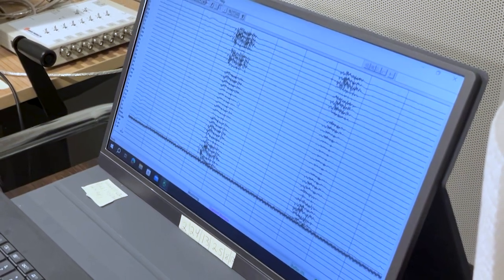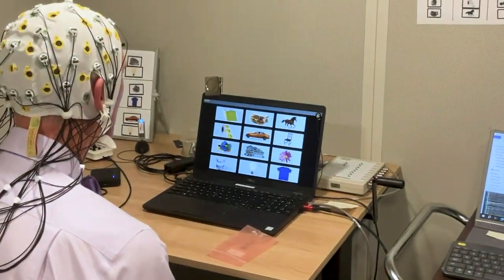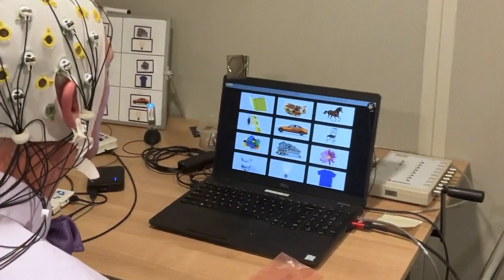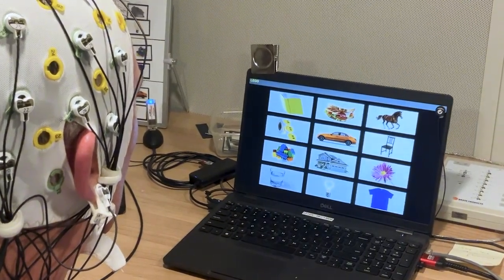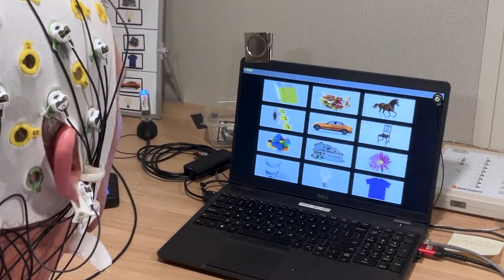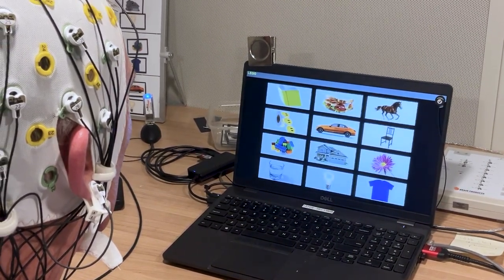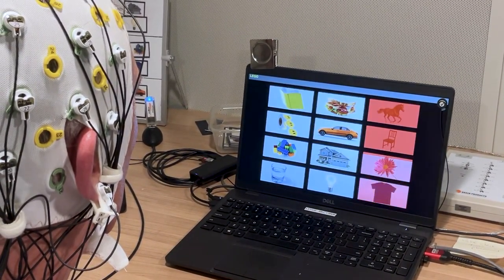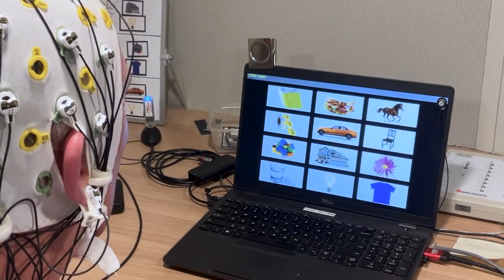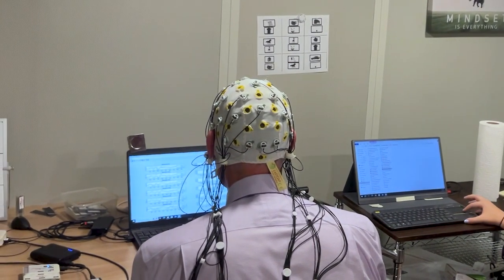So basically the brain signal that we're looking at here is known as the P300. But ultimately the P300 is just related to your attention and that aha kind of moment. So in the context of the BCI right here, you're looking, and every time that book flashes red, you're counting silently in your head or making a noise, but basically you're just paying attention to every time that book highlights. Then this is what the EEG basically looks like.